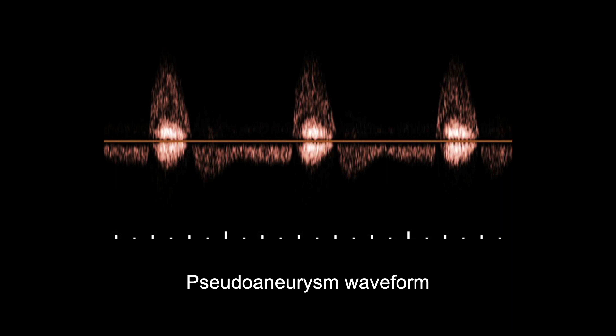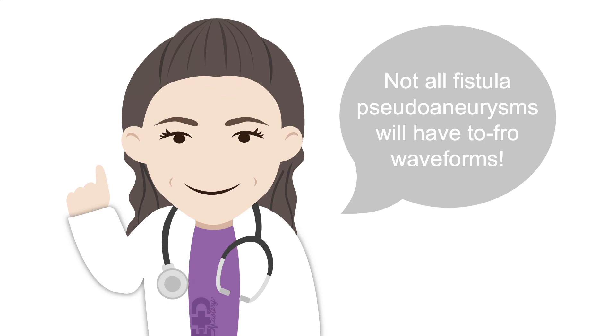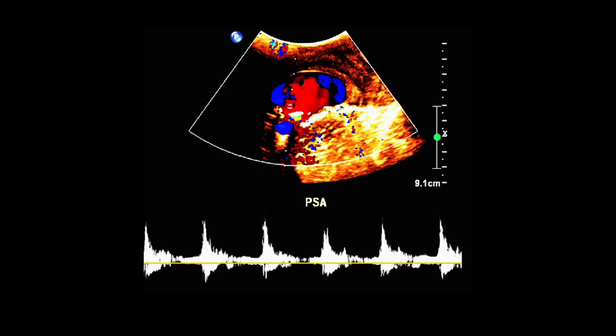On Doppler ultrasound, pseudoaneurysms often demonstrate a to-fro waveform, like in this image where the flow alternates above and below the baseline. Like the yin-yang sign, this is again due to the blood flow moving in opposite directions. These images show another example of a pseudoaneurysm to-fro waveform along with the yin-yang sign. However, note that not all fistula pseudoaneurysms will have to-fro waveforms, although it is characteristic. There may commonly be a less exaggerated to-fro waveform instead, like this example where there is more antegrade flow above the baseline.